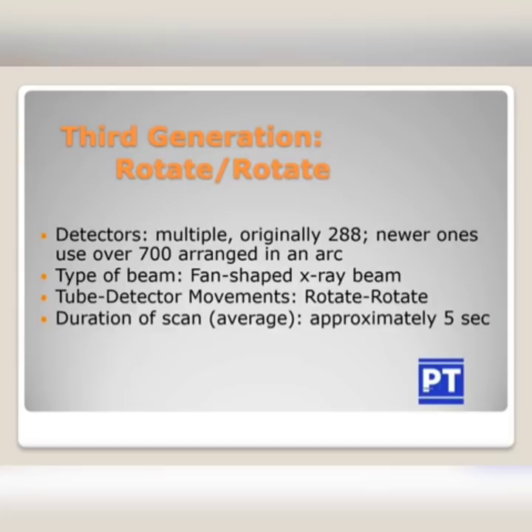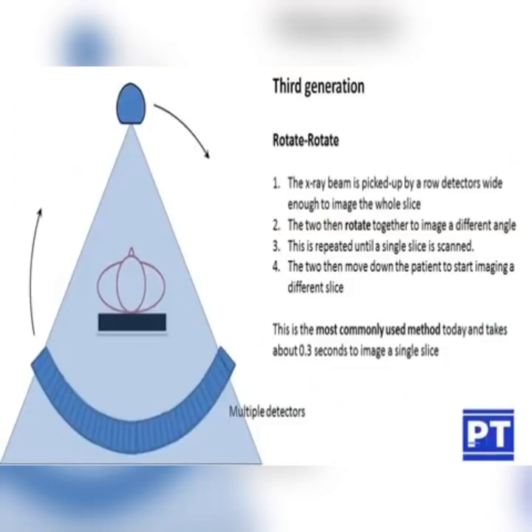The tube and the detector move in rotation only; the linear movement has stopped. The duration of this scan is approximately 5 seconds.